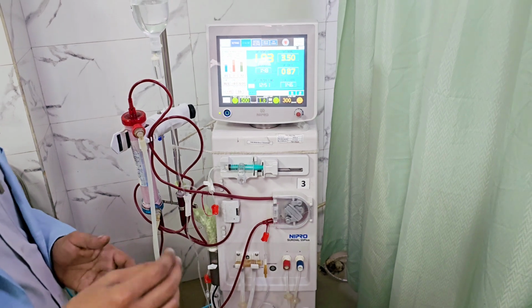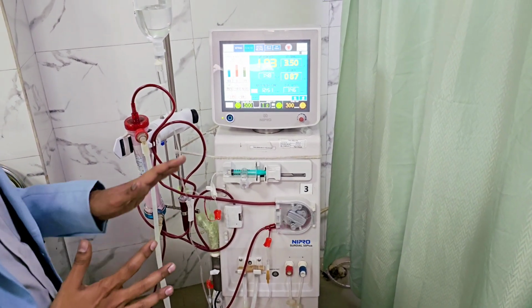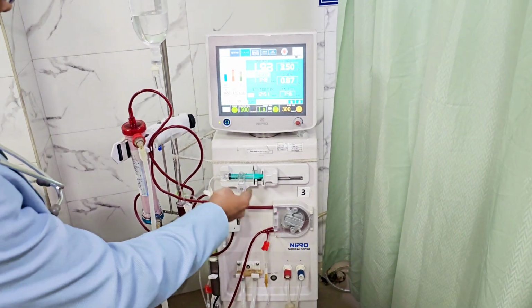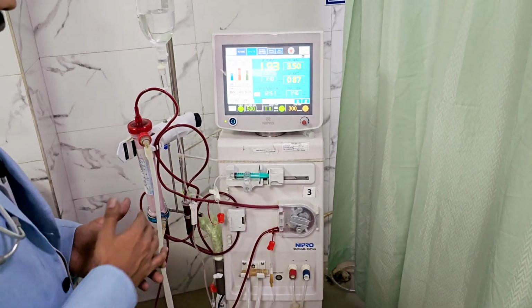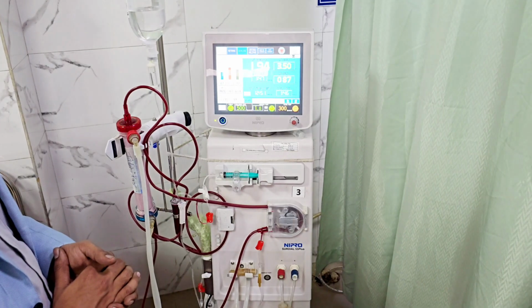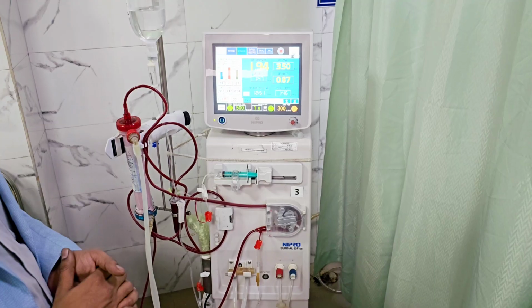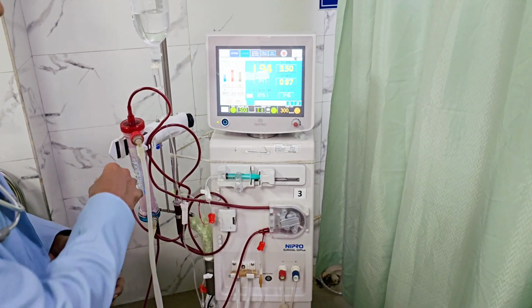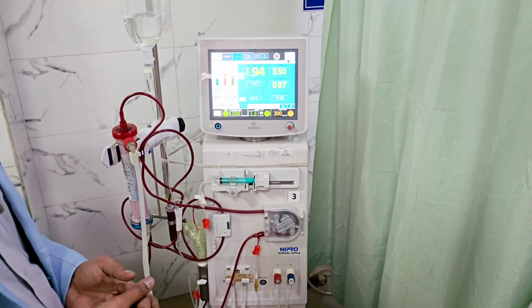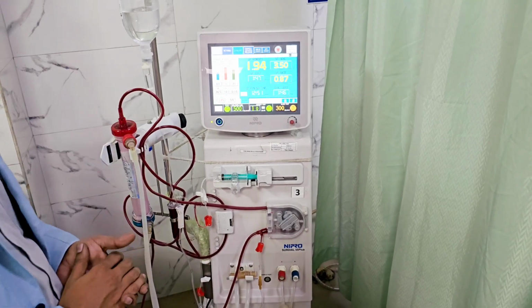It is because of a technique where, in between, we flush the entire circuit with saline. As you see here currently, the blood is coming from the patient through the blood pump, through the dialyzer, going back to the patient. In this patient at least we are giving heparin. Suppose we are not giving heparin. What do we do? We flush this circuit so that the blood will be diluted and clotting won't occur. The problem without heparin is clotting inside the dialyzer and in the circuit also.